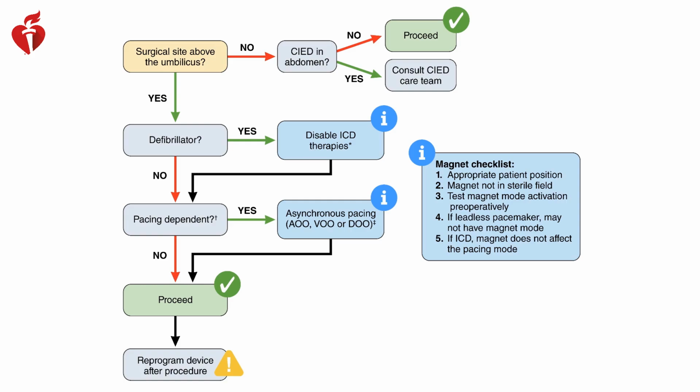We have a magnet checklist. Not all positions, such as prone, are compatible with using a magnet on the chest. The magnet has to be not in the sterile field. We want to make sure that the magnet mode activates preoperatively, especially in the case of leadless pacemakers, where it can be difficult to localize the device with the magnet. And some leadless pacemakers may not have a magnet mode. And if there is an ICD, then just a reminder that the magnet does not affect the pacing mode.